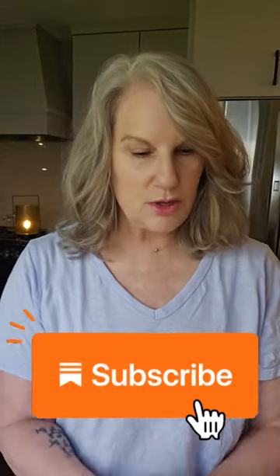Hi everybody, I wanted to give you a little tutorial on how I give my Emgality shot. So Emgality is a subcutaneous injection, not IM, not intramuscular, but sub-Q. And you get this box, you pick it up from the pharmacy, and it will be sealed. I unsealed it right here. We'll open the box up, I'll explain it to you, and my husband will give it to me.